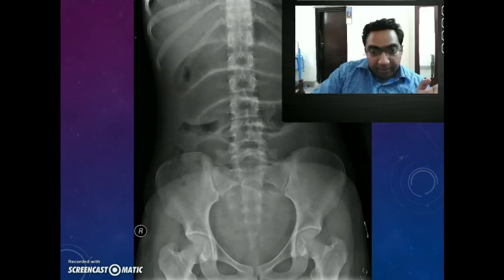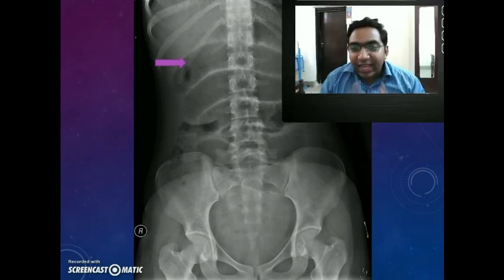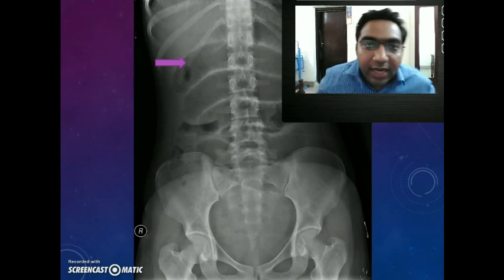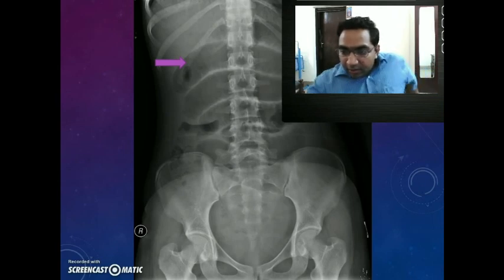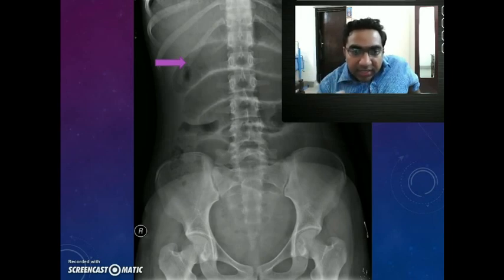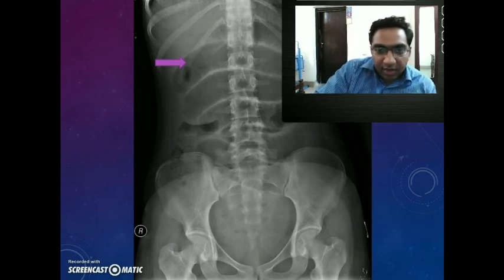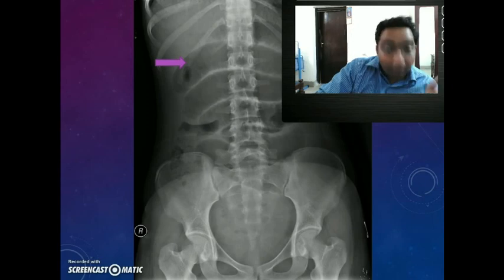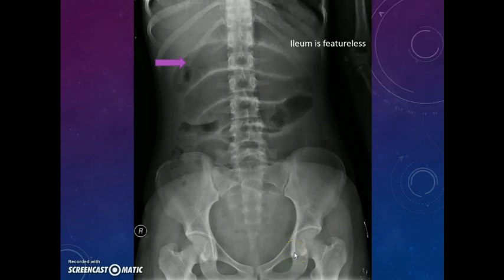What about the ileum? In an X-ray, the ileum is featureless — there is no characteristic feature of the ileum in an X-ray. So where is the level of obstruction in this case? We can say the obstruction is in the distal ileum. The colon is not dilated, the ileum is dilated, so the obstruction will be in the distal ileum. We can identify the level of obstruction from a supine X-ray, provided there are multiple air fluid levels on the erect side.